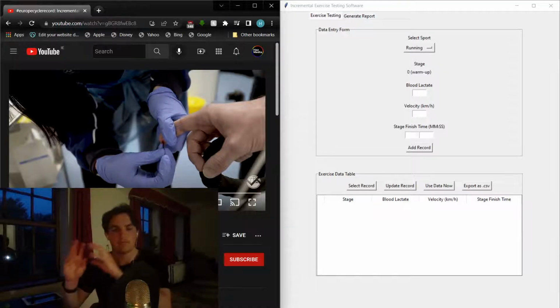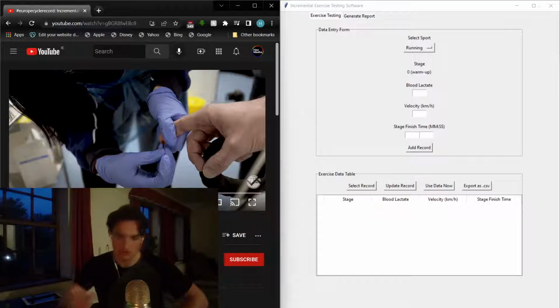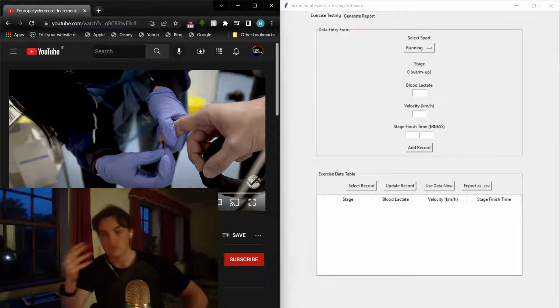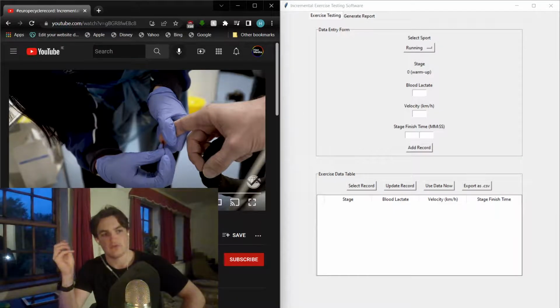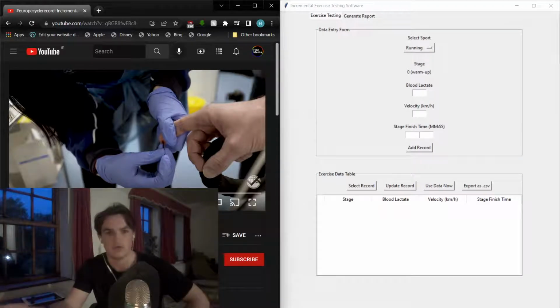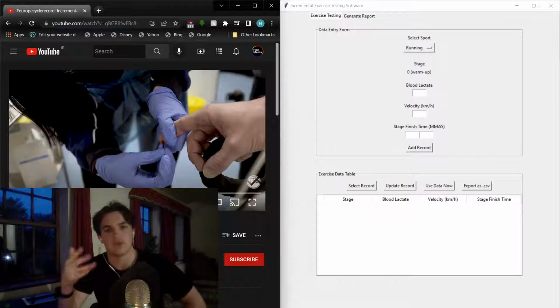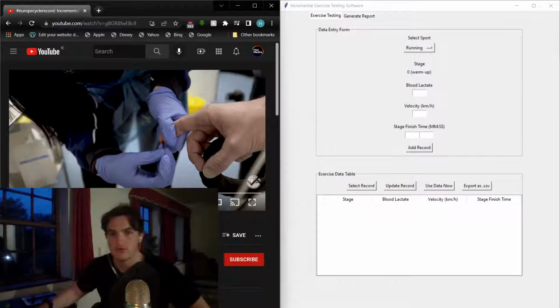And you have your other data set, which is on the computer. It takes the lab technician about 15 to 20 minutes to merge those data sets together and draw useful insights, literally plotting graphs by hand by drawing the X and Y axis and plotting the points. As you can imagine, that's a pain and it's wasting the supervisor's time, who's a doctor or a PhD, and a sports scholarship student's time, and just wasting everyone's time. So he wanted a piece of software that would speed up that process, and hence this software was made.